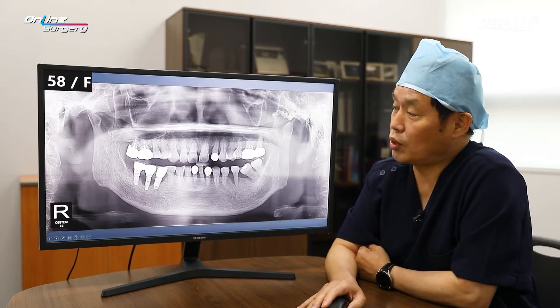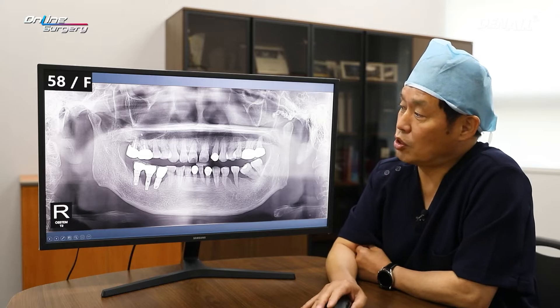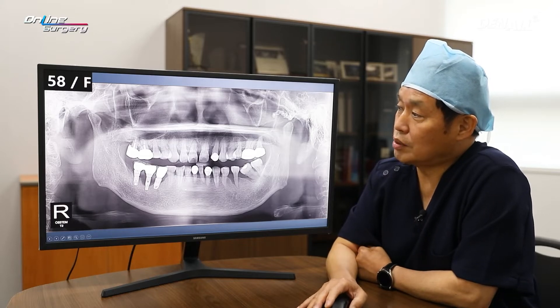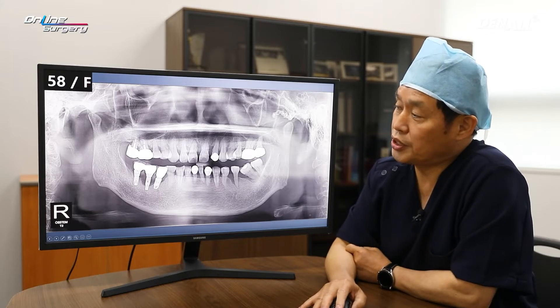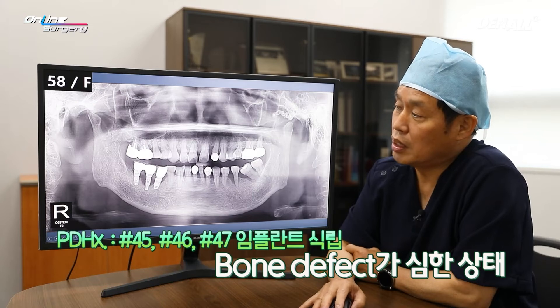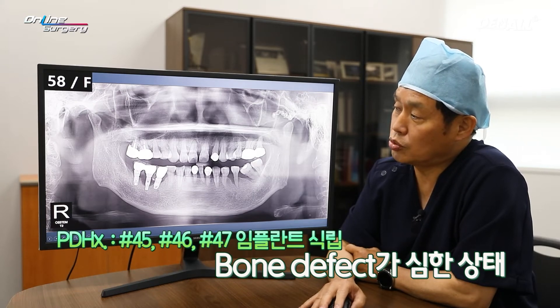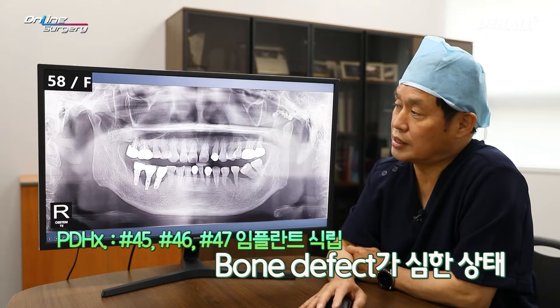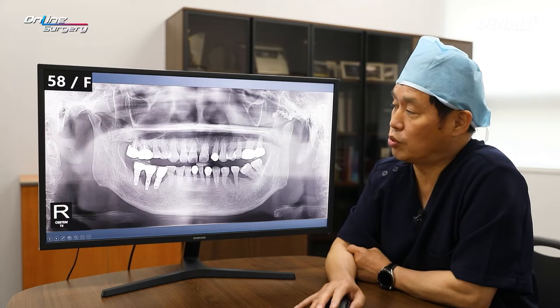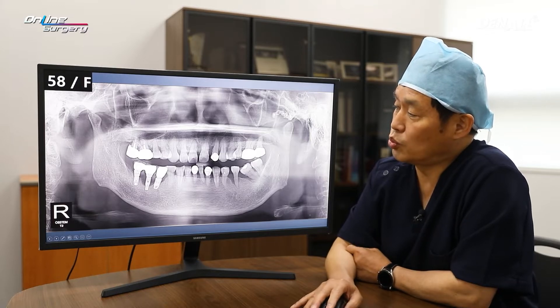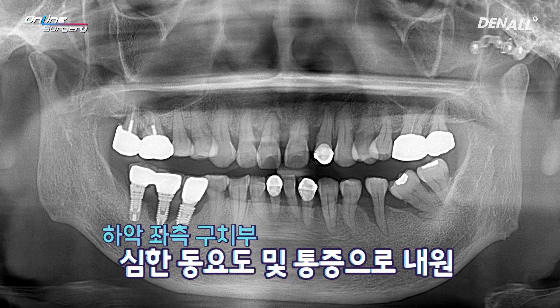First, let's look at the panoramic image. Fifty-eight-year-old female patient. Lower right posterior area — implants are placed, but the one in the middle has a lot of bone resorption and doesn't look very good. However, the patient is saying she's not facing any major discomfort, and her chief complaint is lower left posterior area. There's a lot of mobility and pain, and she wanted to solve this.